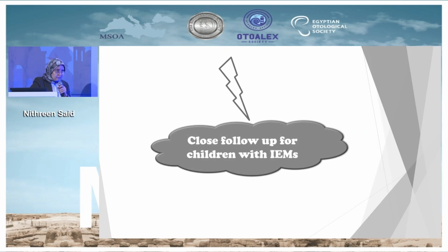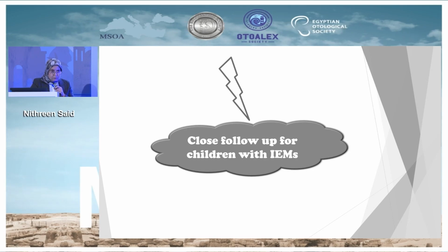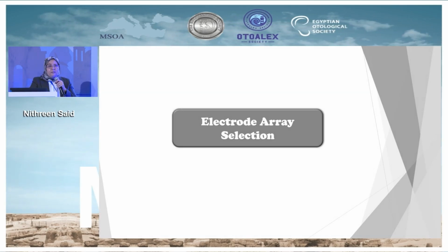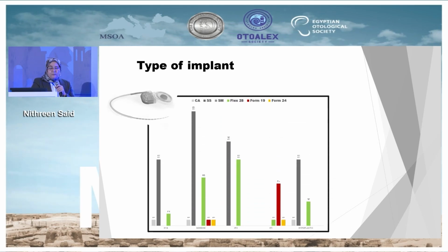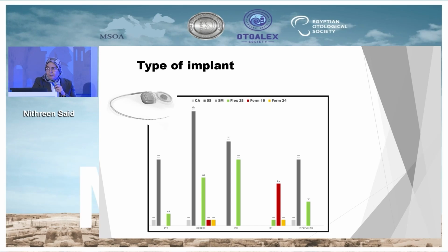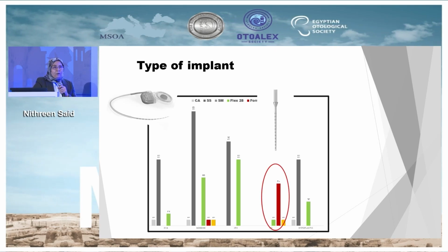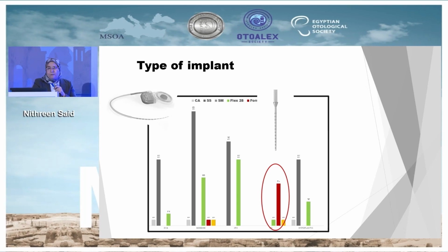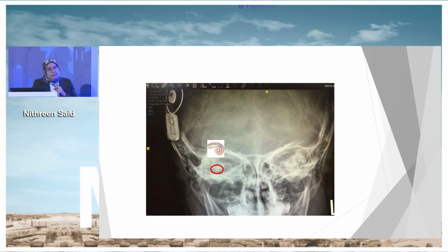As audiologists, we have to know that the patient has an anomaly, so radiology results are very important to us. Regarding the electrodes we use for those patients, we prefer to use straight electrodes, even in patients with short modiolus, and we use the form electrode for IP1 and IP3 cases because of the high possibility of developing a gusher. What happens if we use a modiolus-hugging electrode in a short modiolus patient?